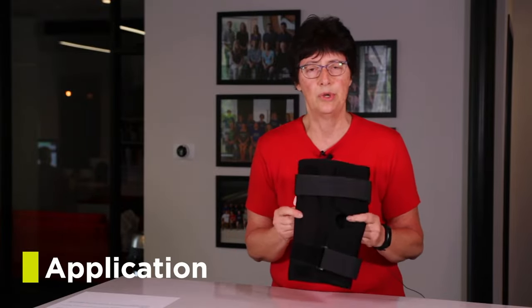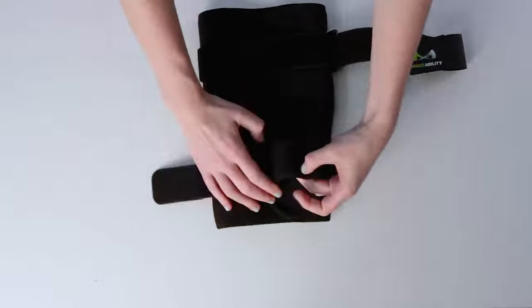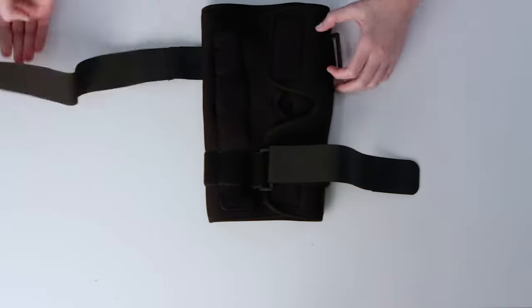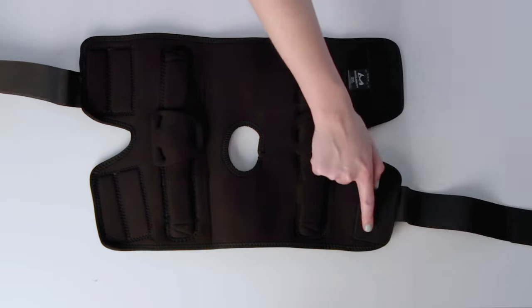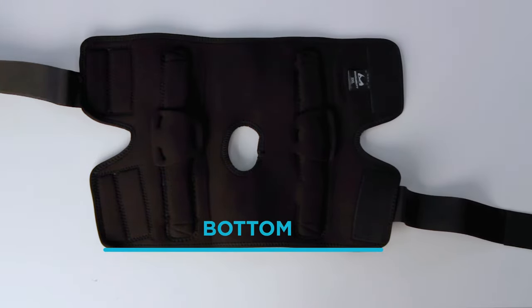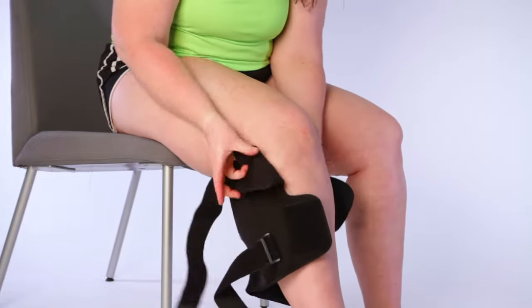How do I wear it? How do I put it on? When you put it on you need to undo the straps, lay the brace flat and identify the top and the bottom. The top is going to be a little bit wider than the bottom because your thigh is larger than your calf. Position the brace behind your knee with the tag in your left hand.